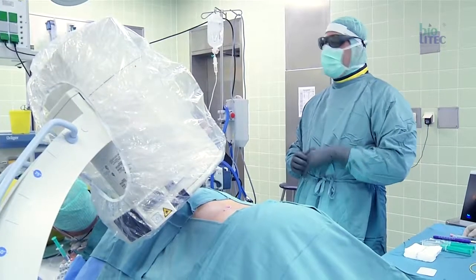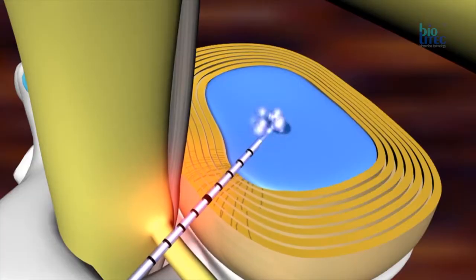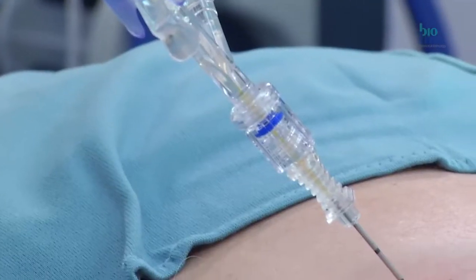Percutaneous laser disc decompression, in short PLDD, is an effective hyperthermal minimally invasive treatment for contained disc herniations. The precise application of laser energy into the nucleus pulposus of a disc reduces intradiscal pressure, leading to a reduction of nerve root compression. The laser heat also achieves a thermal destruction of intradiscal nociceptors, which are often responsible for a discogenic pain syndrome.